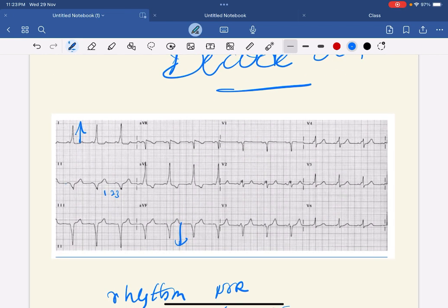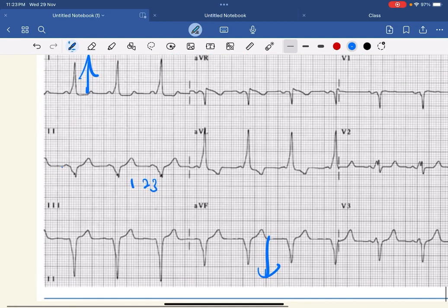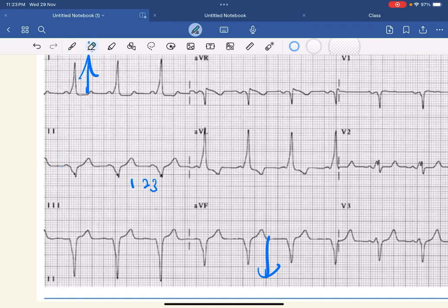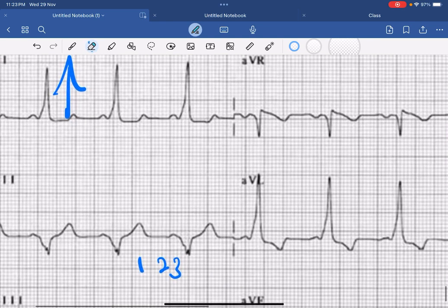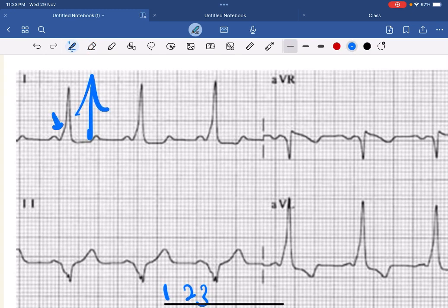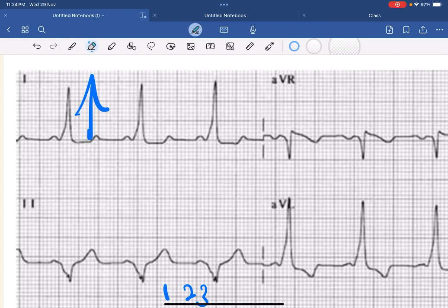Next, comment on the P waves — all are similar looking and normal in nature. After that you have to see the QRS complex. Especially here in lead 1, there is a slurred upstroke of the initial part of the QRS — see here, it has gone like this. These are called delta waves.